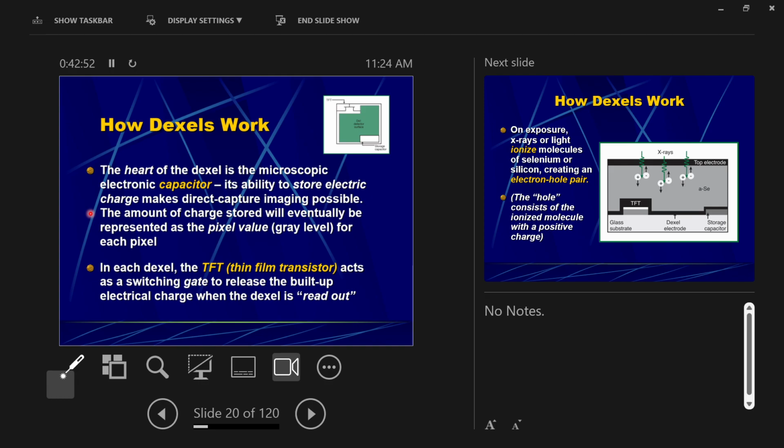Have you guys done that in the x-ray rooms? Have you inverted your x-rays, turned the black to white and white to black? You can, it's sometimes useful. So Valeria, you said yes, right? What's an example, what's a time when that was useful to invert the colors? The doctor wanted to see a fracture. Yeah, sometimes seeing fractures, it can be helpful, right? It's just an extra tool. If your eyes are having trouble seeing things one way, flip-flopping all the shades of gray is one thing to do, right? So you can definitely do that.